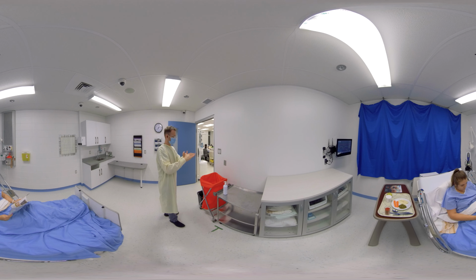The nurse then unties the laces at the neck and waist of the gown. He grasps the neck laces and pulls them downward toward the elbows to free the shoulders. He then grasps the inside of the sleeves at forearm level and pulls the gown away from the body. He then pulls it off completely and rolls it into a bundle without ever touching the outside of the gown.